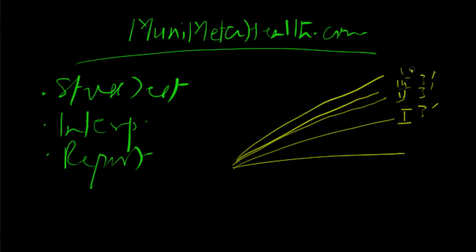And stage 4, most patients don't get there, but if they do, obviously they're in great shape. Just so that you know, normally most marathoners, I tend to give them a little warm-up time and immediately get them to stage 4 and let them run on that. So essentially you want to have the person walk as much as possible.